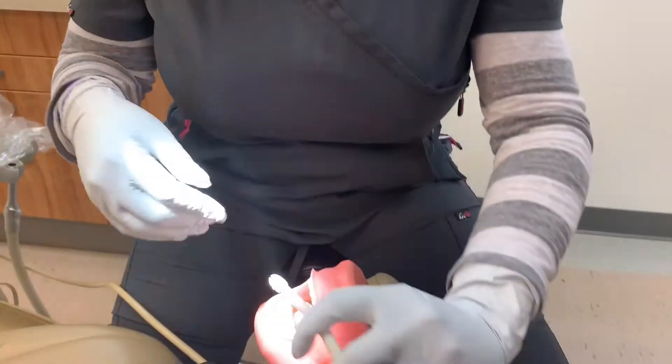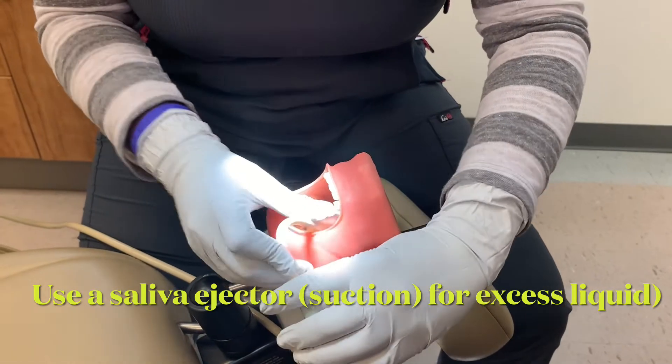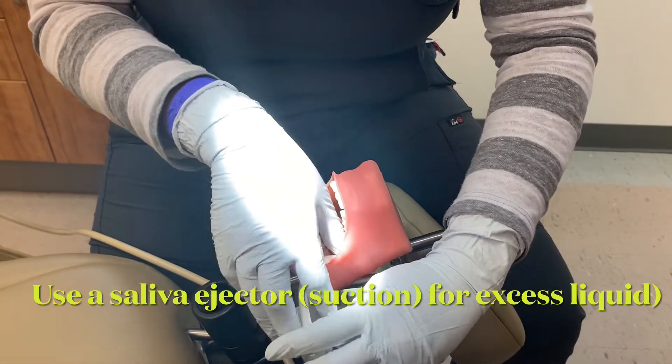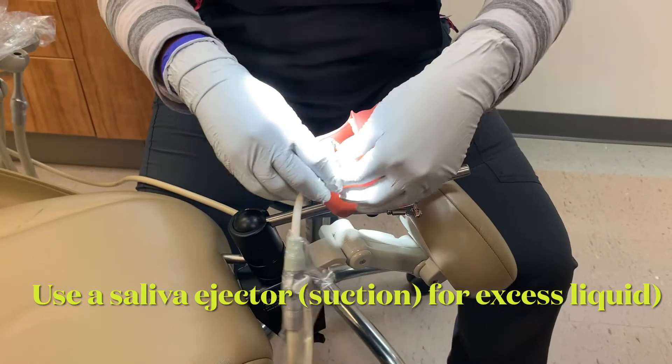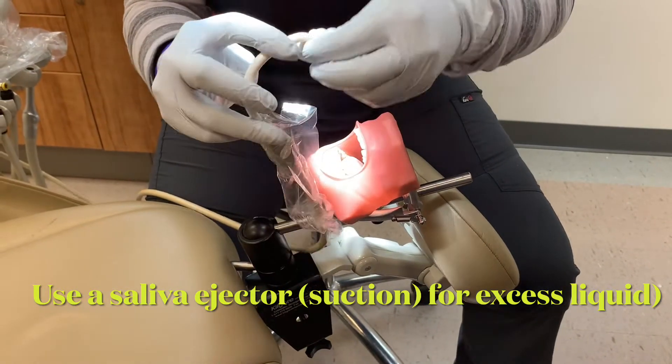Using suction or a saliva ejector so I don't flood my patient, because I'm going to have excess liquid in the patient's mouth.